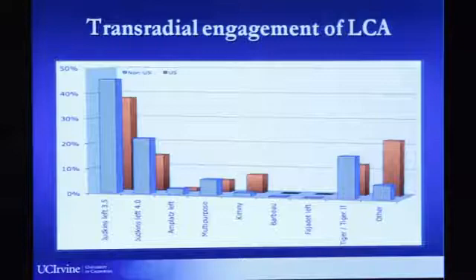How about engaging the coronary arteries and engaging the left coronary system? Most of the world is using the Judkins left 3.5 for engaging the left coronary system, followed by the JL4. This is very different from the transfemoral approach where we use JL4 most of the time.